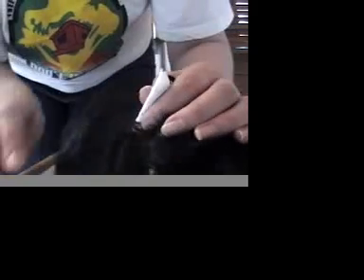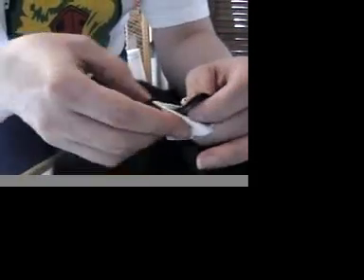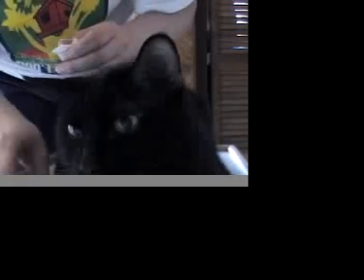That's pretty good. He had insulin about six hours ago, so this is probably as low as it will go. Sixty-six is a pretty normal number — most of my non-diabetics test in the sixties on this meter. And that's it. Very simple. Thank you, Louie.